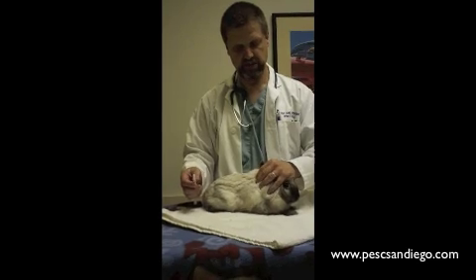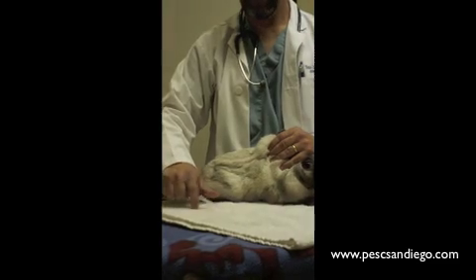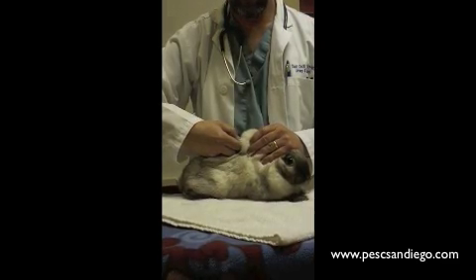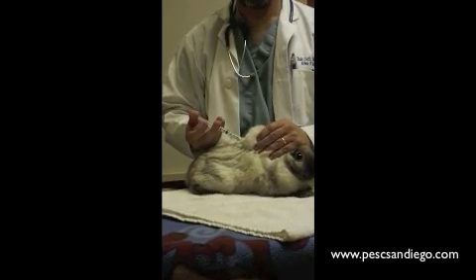What I like to do is pinch up the skin. You're going to make a little furrow right here, and we're going to insert the needle. Once you feel it pop through the skin, you can then push the plunger to administer the medicine.